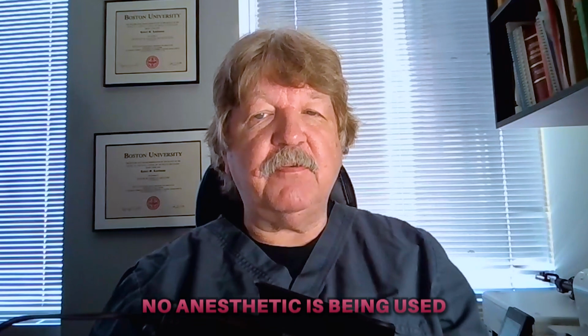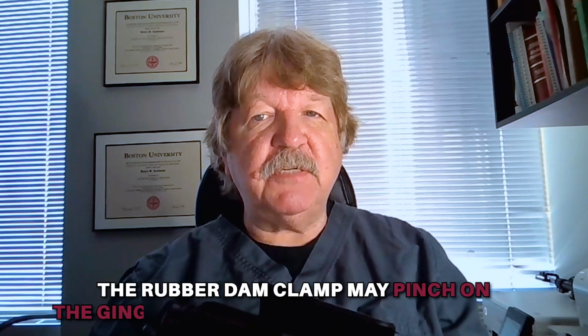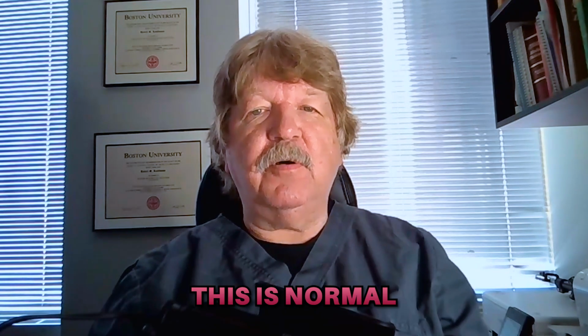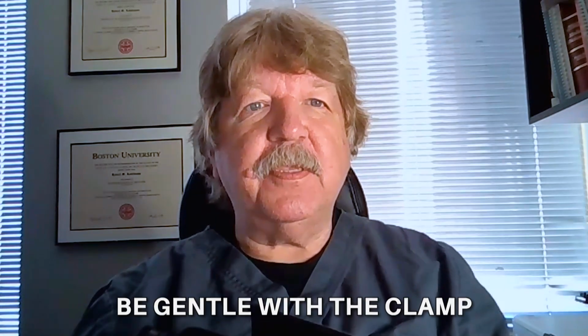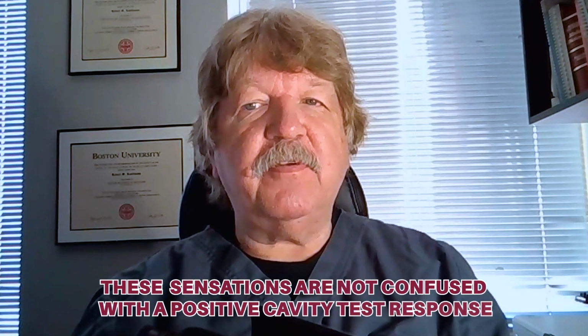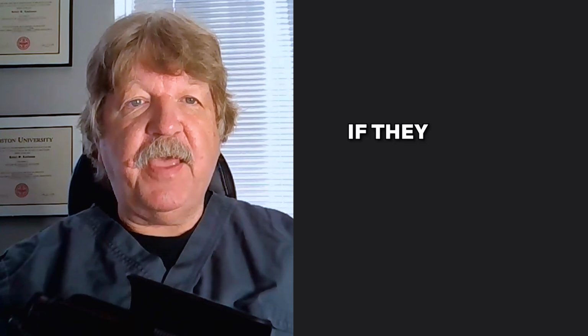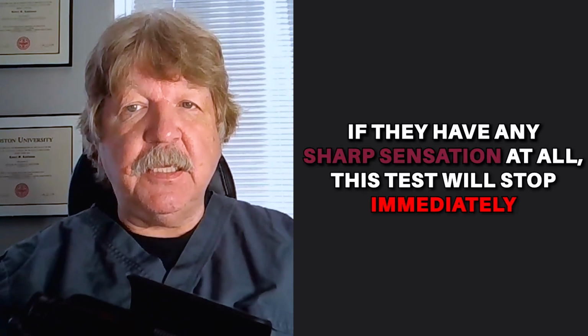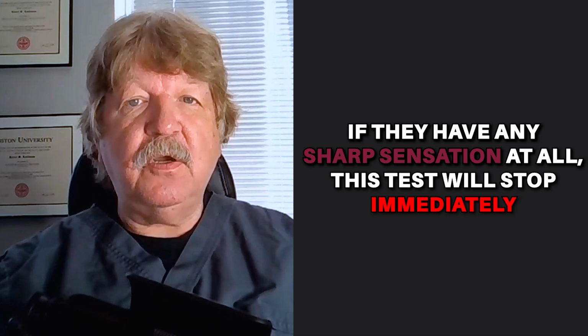It's important that the assistant placing the rubber dam explain, because no anesthetic is being used, the rubber dam clamp may pinch on the gingiva a bit, or this may feel a bit tight around the tooth. This is normal. Be gentle with the clamp. We must make sure that these sensations are not confused with a positive cavity test response. The clinician explains to the patient that if they have any sharp sensation at all, this test will stop immediately. The patient is in control.